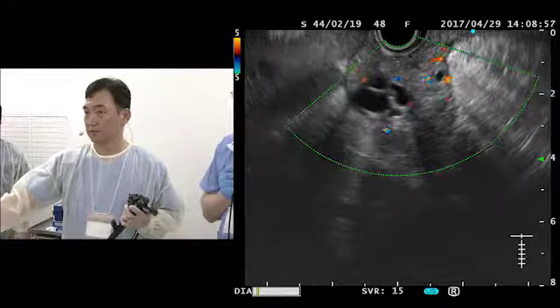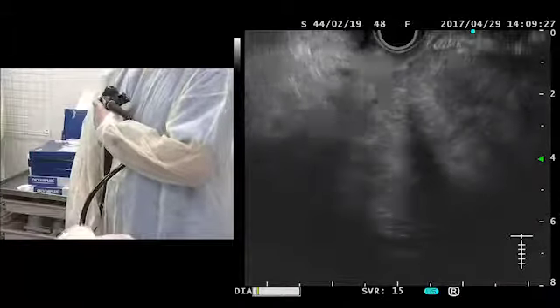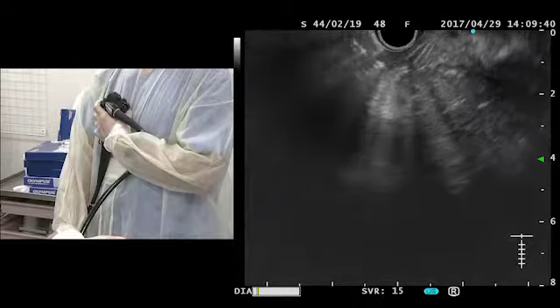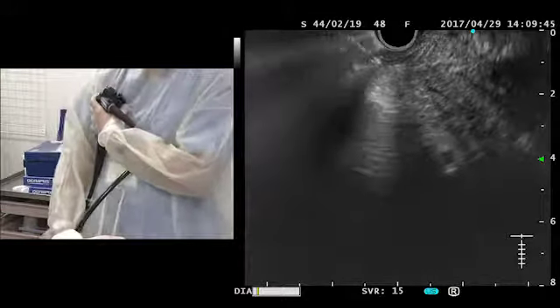So once we finish the long position, I'll make a short position and scan from the distal end of the pancreas head. And first try to identify the ampulla, carefully rotating right and left. Here's the duodenum going into the third portion from the second portion. And typically you torque towards the back and you start to see the normal pancreas duct. It's very tiny. So this pancreas head near the ampulla is actually normal up to here.